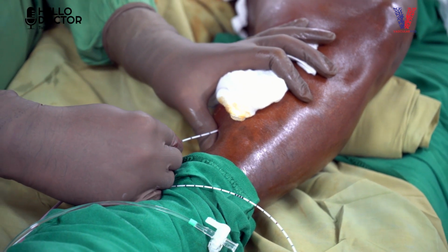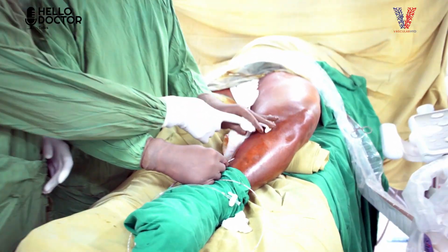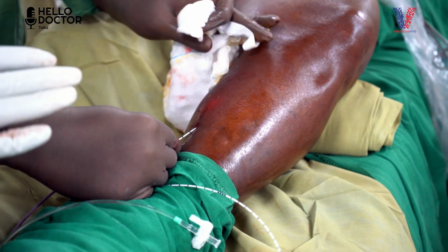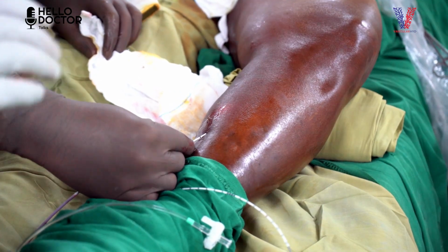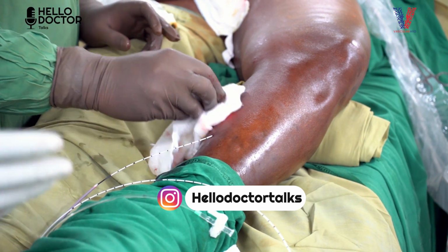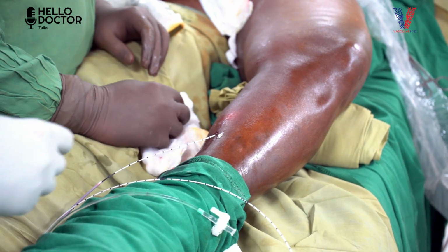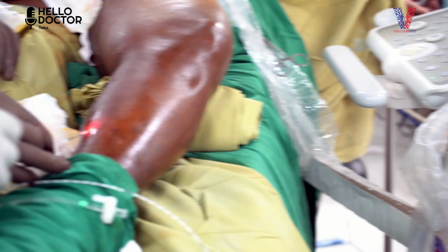So now we are nearly at the end of the procedure. The laser fiber, as you can see, here is the glow, and we are very close to our access point. Before we completely come out of the skin, we switch off the laser and then bring the laser fiber out, so that we don't burn the skin, and the laser energy does not damage our eyes or ourselves. Right, so now we remove it.